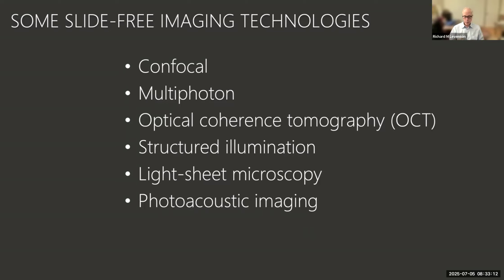Nothing is being done, costs are going up, or they have to go home and come back. Lots of costs, lots of inefficiency. So there are now multiple optical techniques being developed to really address the problem of why do we have to wait so long to make a slide and read it. And I'm not going to describe these in any detail. I'll just list them as new techniques, which are really in their own way making major advances.